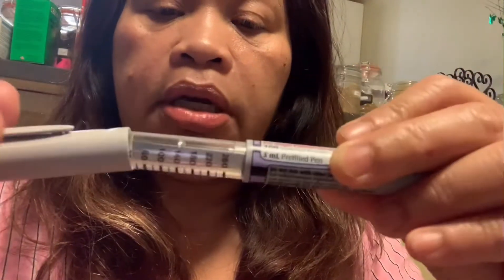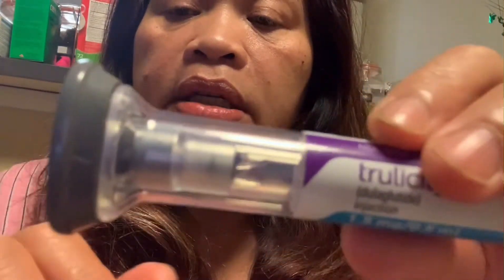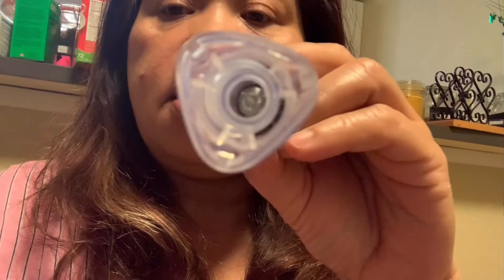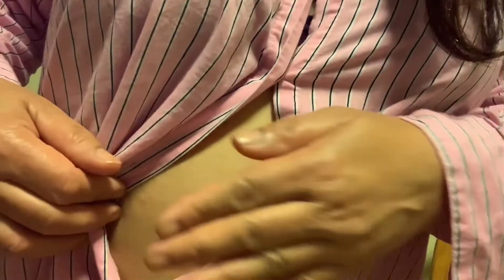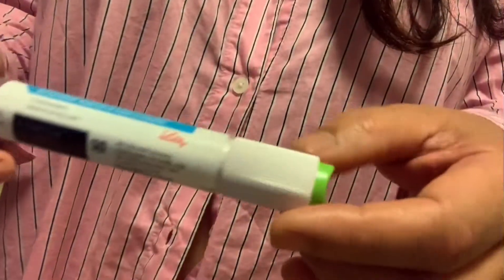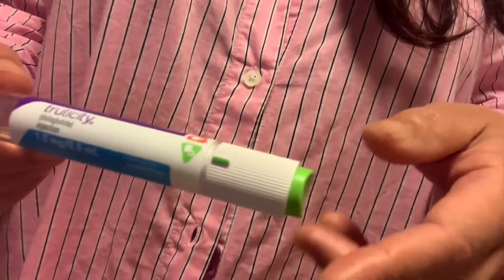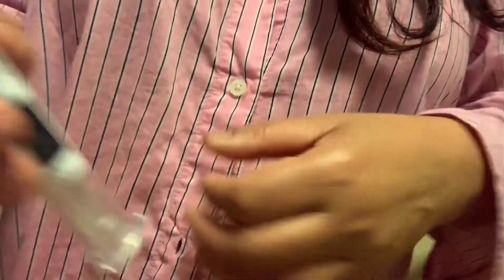Then you put the pen and it's ready to inject. You open the bottom and there's a long needle inside. I put an alarm because you have to inject it on the same day — like if you use Tuesday, you have to do it every Tuesday so you don't miss it. I put an alarm so I don't forget, and today is Tuesday so I'm going to inject it.